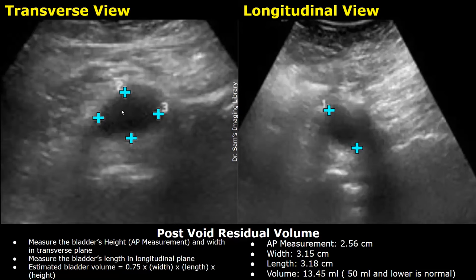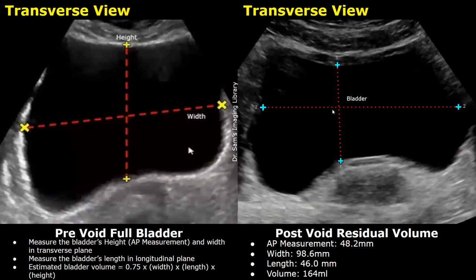After urinating, the bladder appears very small in these images. In this example, the AP measurement was 2.56 centimeters, the width was 3.15 centimeters, and the length was 3.18 centimeters. This gave a volume of 30.45 milliliters, which is normal. So this bladder has a normal post-void residual volume.